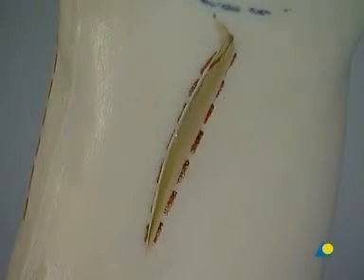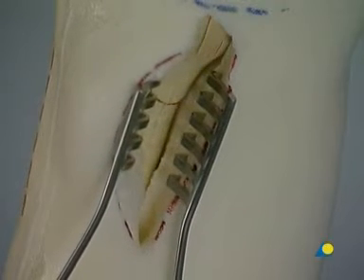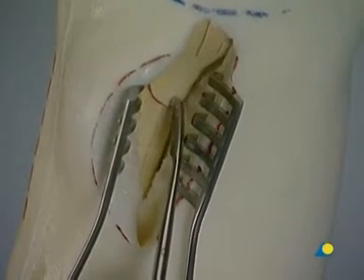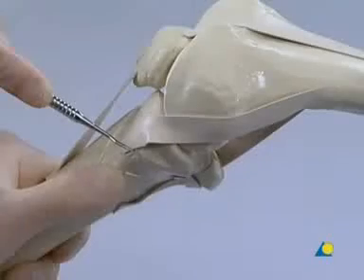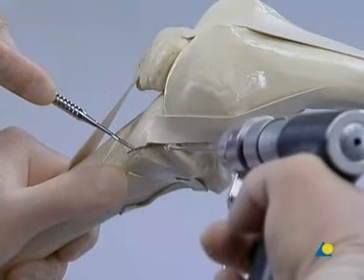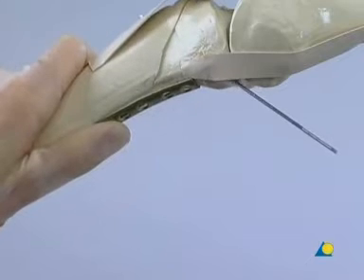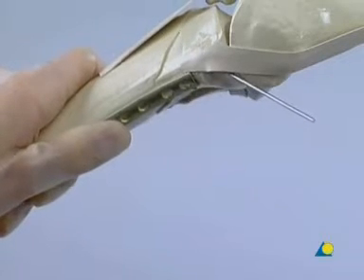After clearing the fracture gap, a reduction is achieved by pushing the medial bone block upwards. Preliminary fixation is done by inserting a K-wire, begun close to the joint surface, then angled downwards so that it ends in the tibial shaft. A five-hole one-third tubular plate is positioned on the posteromedial crest of the tibia; only minimal plate contouring is required, if at all.